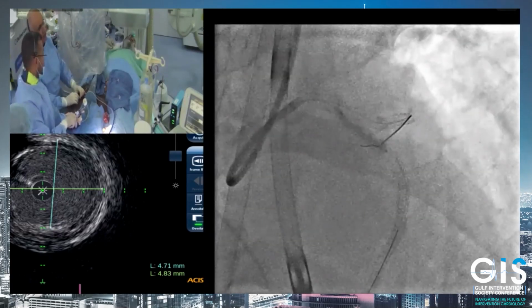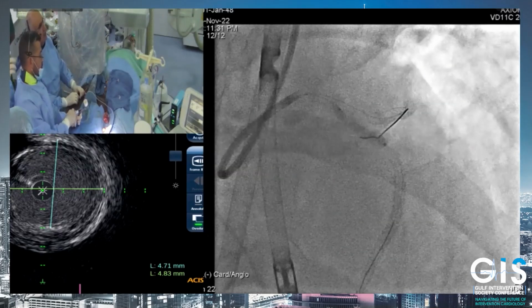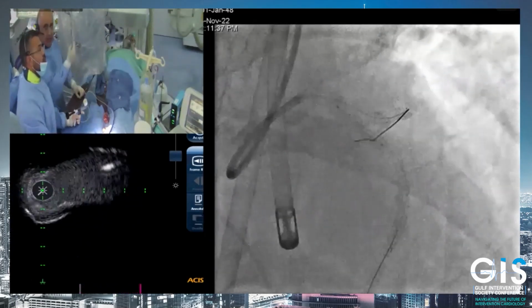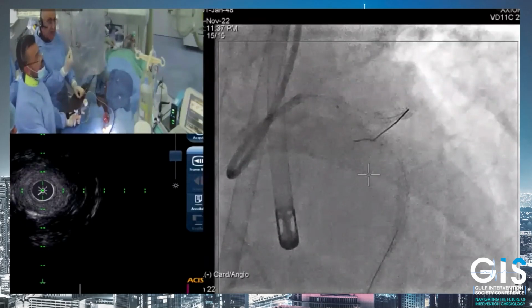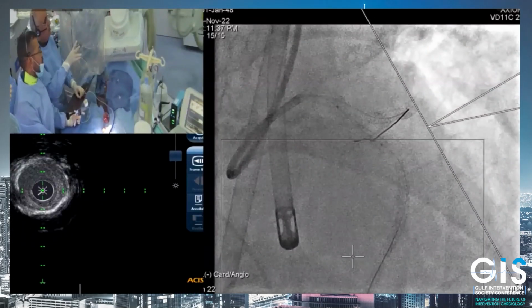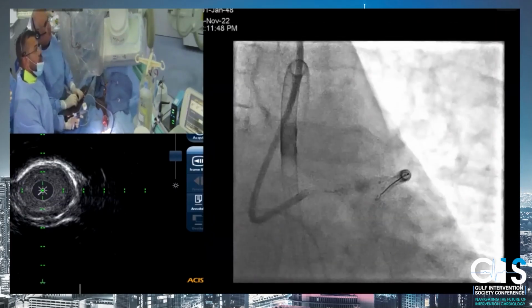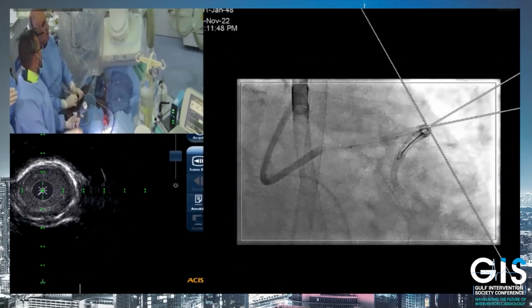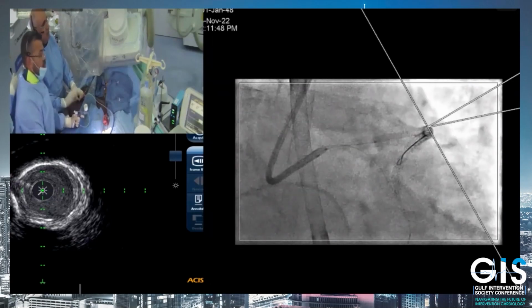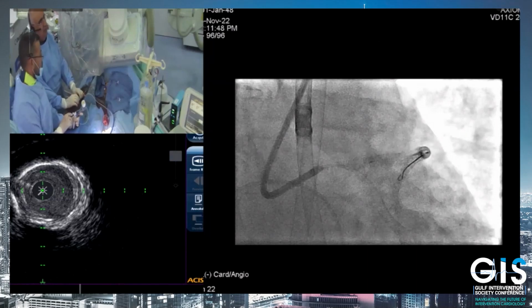20, yeah, okay. Can you give us the measurement for the stent, please, downstream? So this is the proximal end of the 20 stent. This is 3.5, Arif? Go to PA caudal, please. I'll try to make a measurement also with the balloon, and we have certainly an image. More distal, a little bit more distal. This is 20. Yes, test here, please. Measure, just measure. So this is another 20, so 40, 38 to 40 something.